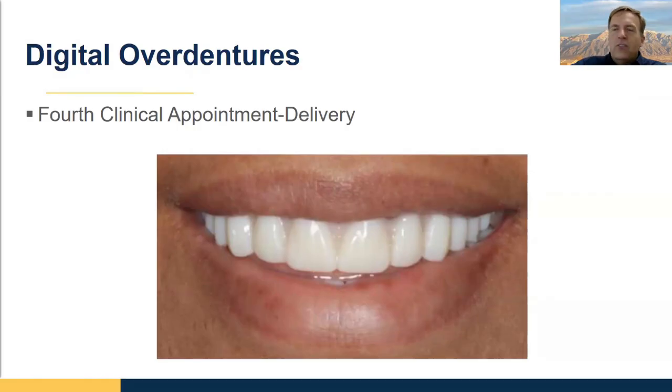One of the things about this is you really want to talk to them about the attachment replacement schedule. They'll probably need to replace the inserts every 6 months-ish and the attachments, the abutments, every 2 to 3 years. A good conversation to have at the front end, so your patient's thinking about total cost with this, not just the upfront cost.